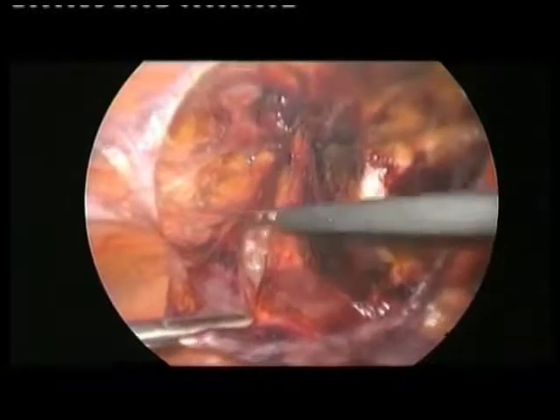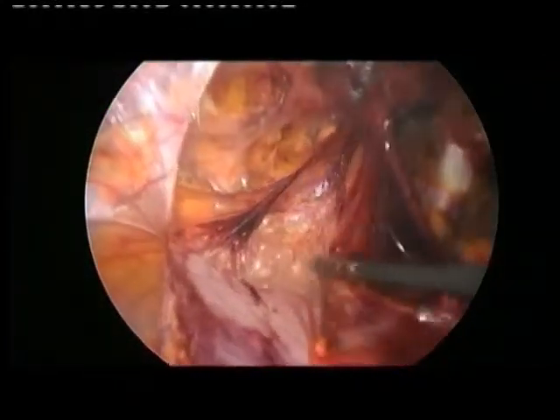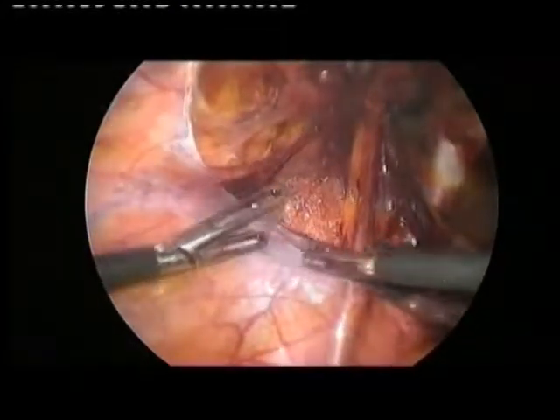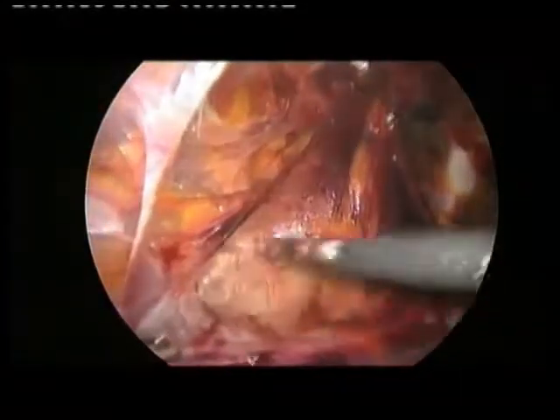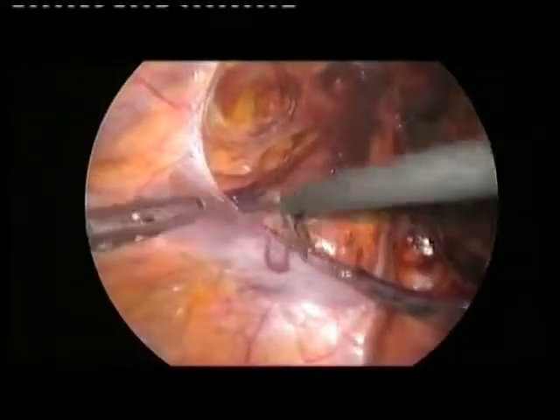So usually it takes 10-15 minutes. It's always better to prepare more than less, so we have enough space to put the mesh. Okay, go up.